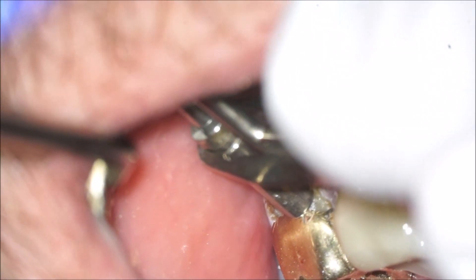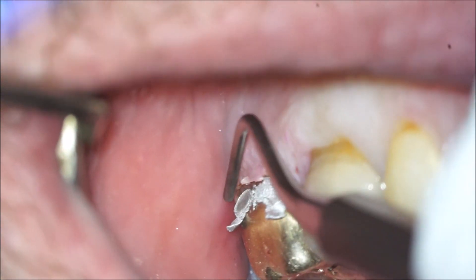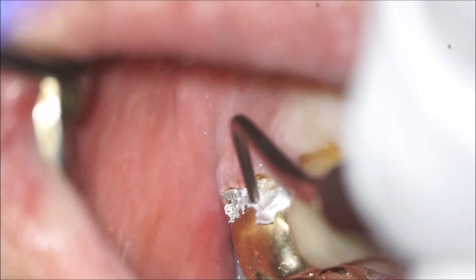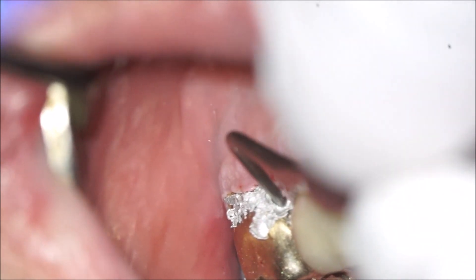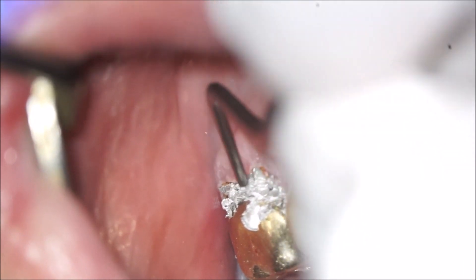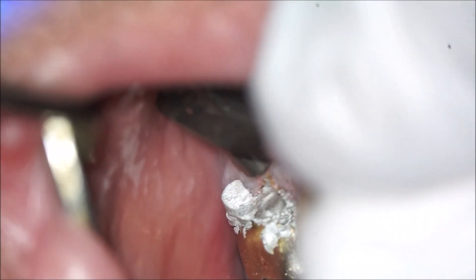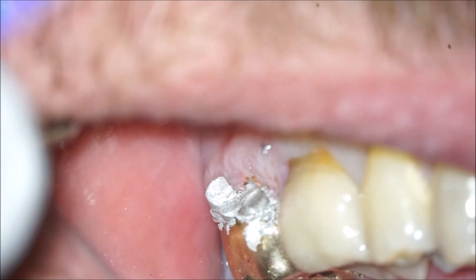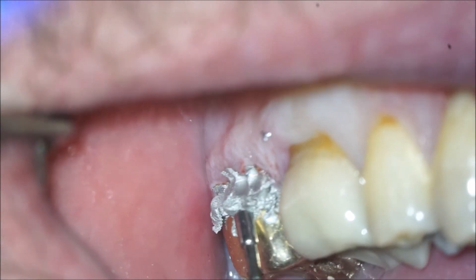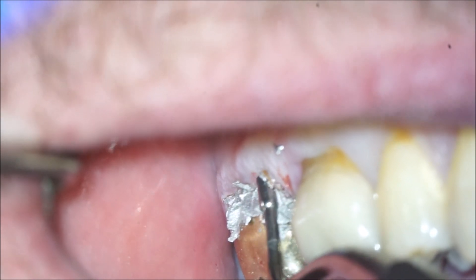Here we come with the amalgam. The head of this amalgam carrier is really a little bigger than would have been ideal — if you've got a smaller one, I would generally suggest using that in a small preparation like this. But it got the job done. I'm using a really small condenser to pack it up under the crown margin down into the undercut on the apical portion. Condensing this really well — you'll notice there's no bleeding, oozing, or saliva getting on the amalgam, which is going to contribute to a much better seal. As I get toward the outside of the restoration, I'll use the side of the condenser to get more surface area, which allows me to pack it in without gouging down into the amalgam.